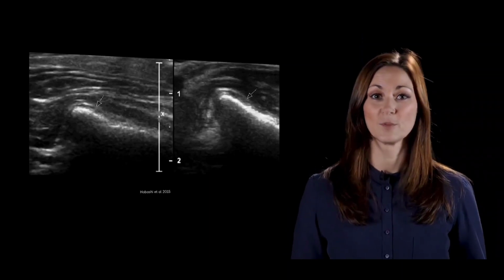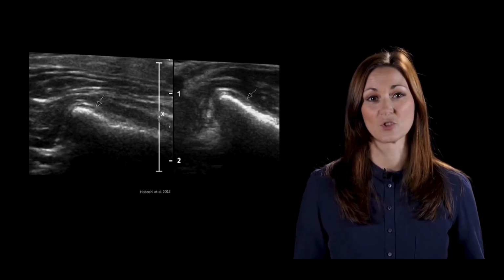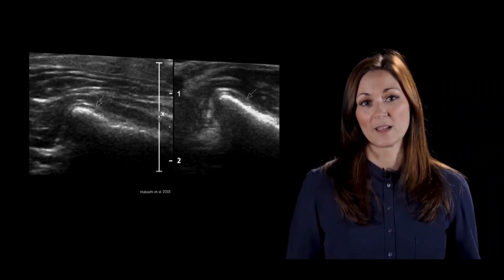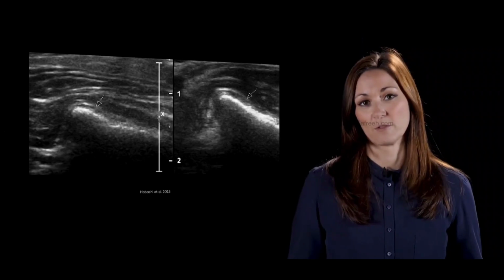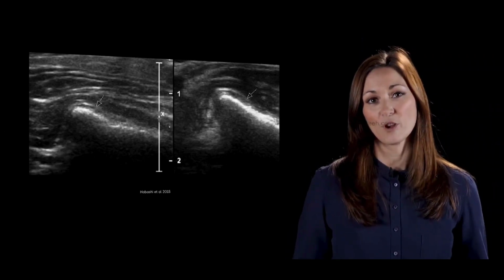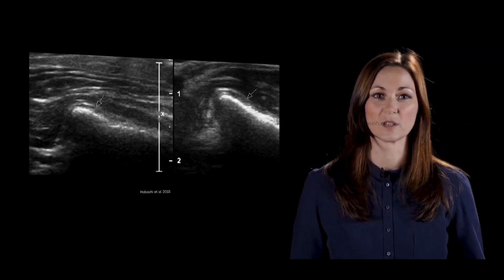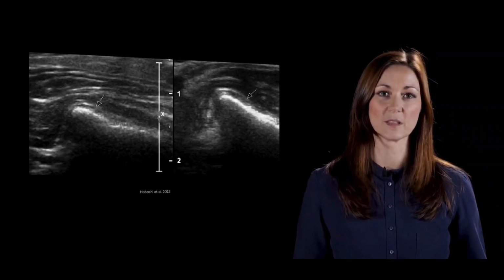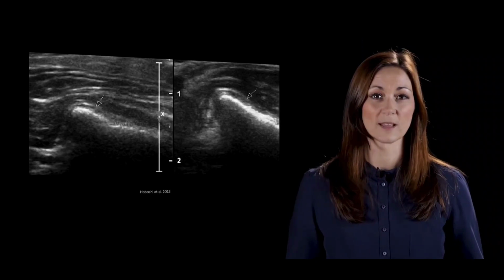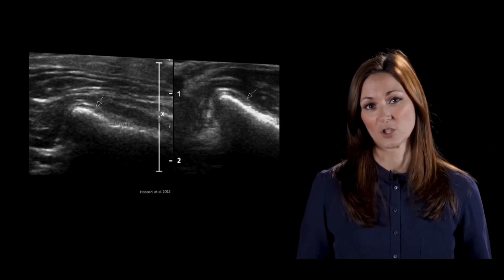Scanning the temporomandibular joint and its disc kinematics during functional movements can be done, but it is much more complex and requires lots of experience. The temporomandibular joint is a closed joint. The presence of bones prevents a clear view of the soft tissue structures. The disc is small and scanning the disc during movement is challenging.